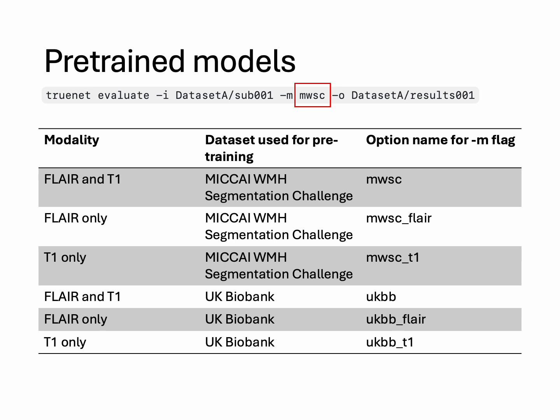task. I don't want to go into much detail, but it is actually trained in a more sophisticated manner to overcome the shortage of training data that we used. So I would recommend the MICAI challenge dataset because it was trained on a slightly larger dataset, but the UK Biobank dataset has also shown good results.